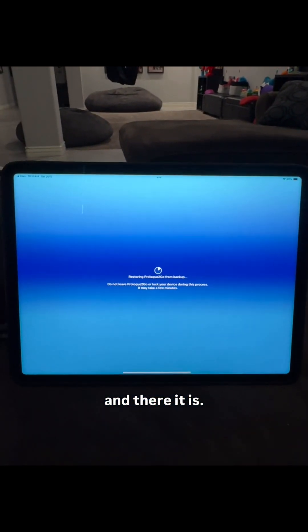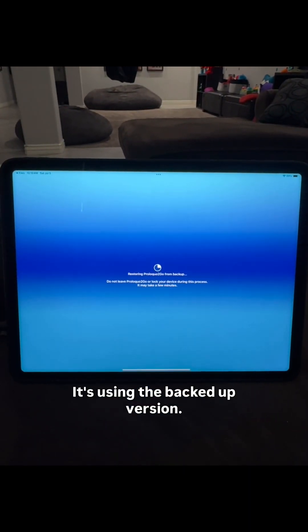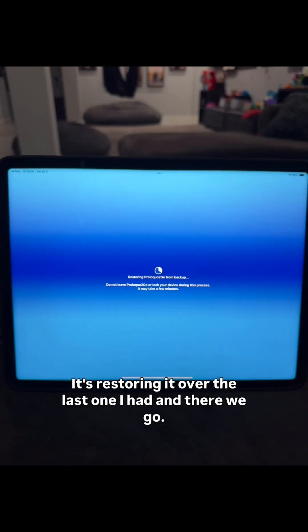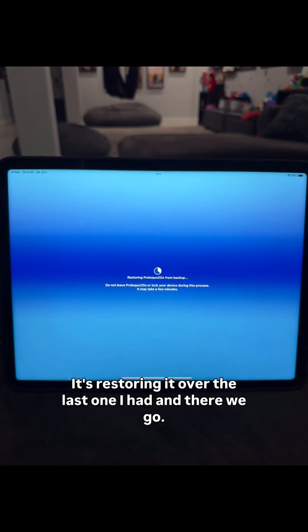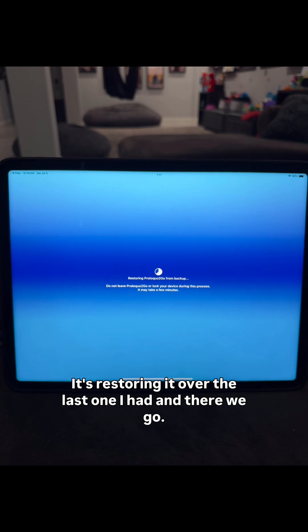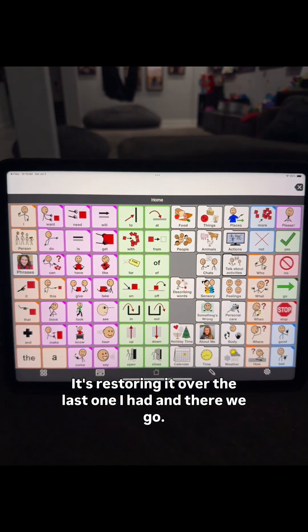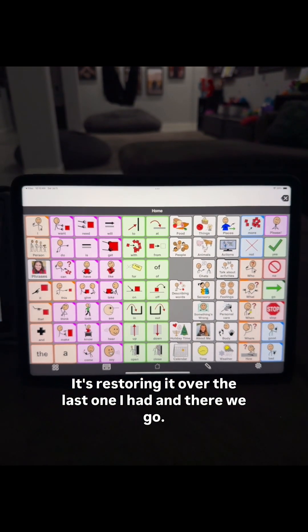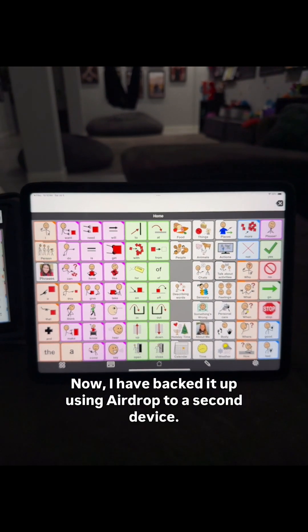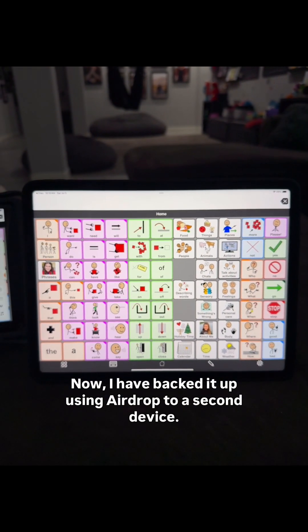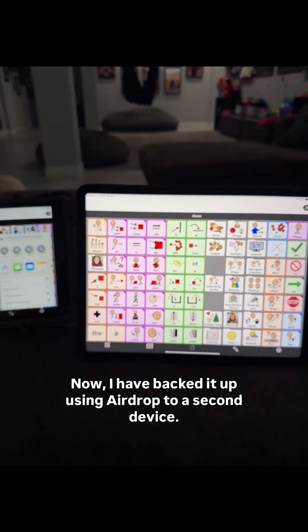And there it is — it's using the backed up version. It's restoring it over the last one I had. And there we go. So now I have backed it up using AirDrop to a second device.